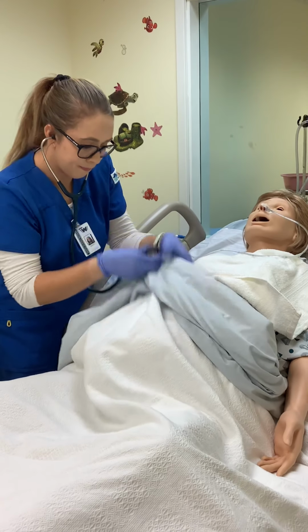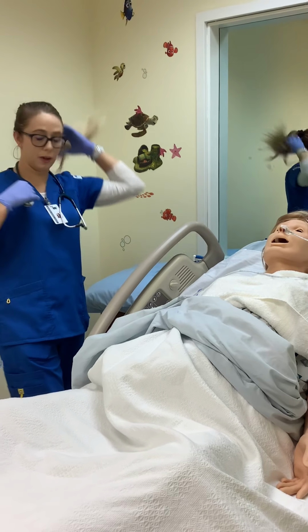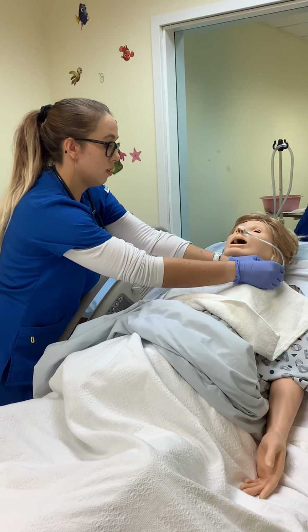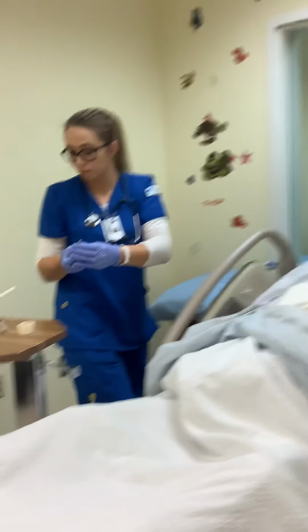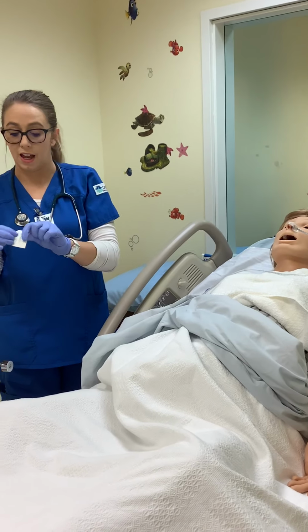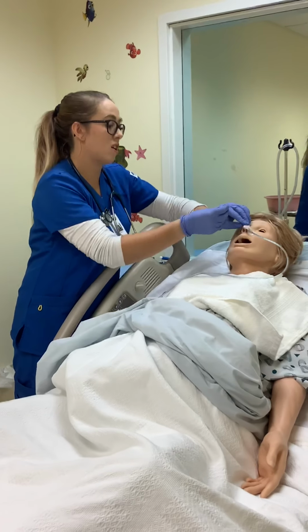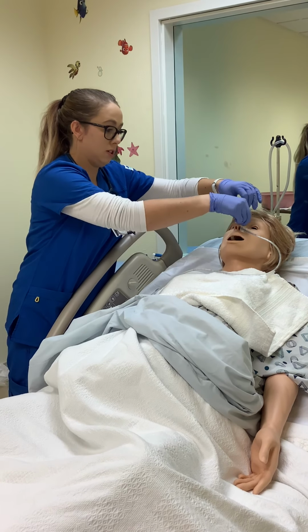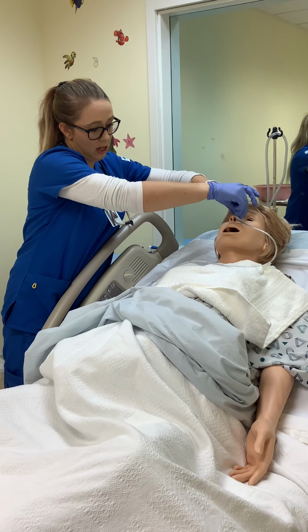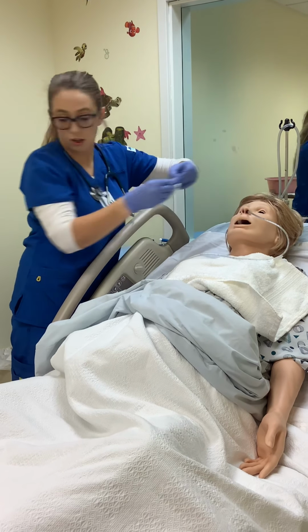Okay. All right. So feeling a little better, huh? Okay. So now we will take the safety pin off, as well as I would take an alcohol swab. Usually it's an adhesive swab for the bandage on the nose to help get it off. So we'll just help do that. Kind of help get that off there. There we go. Good, okay.